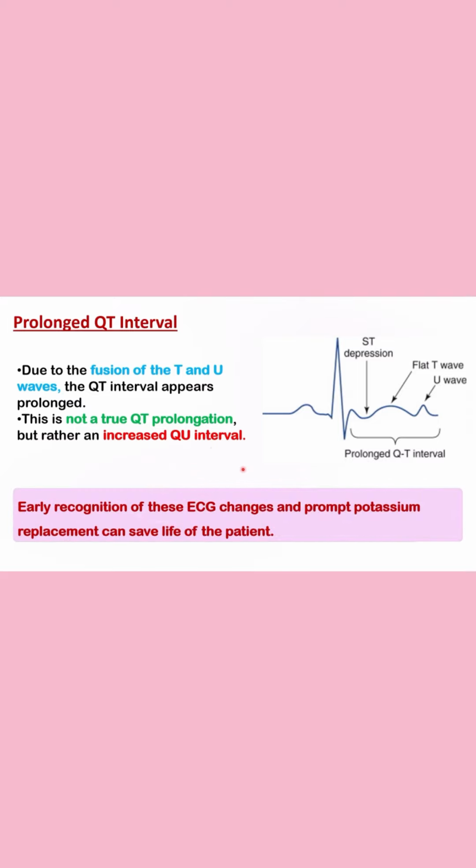And these are the ECG changes which we find in hypokalemia. Early recognition of these ECG changes and prompt replacement of potassium can save the life of the patient. So that is why we should know all these ECG changes well.